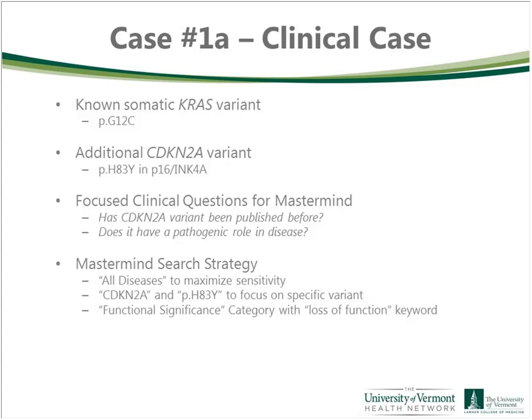So both of these cases are non-small cell lung cancer. That currently represents the highest volume at our practice as far as the samples that we receive to sequence. And in this first particular case, one of the two interesting variants we found was an activating, well-described KRAS variant, the G12C. So I'm not going to spend any time on searching for this variant because I'm sure anyone who's signed out NGS assays or any of the classic molecular tests probably has, by this point, a canned comment for the KRAS variants.